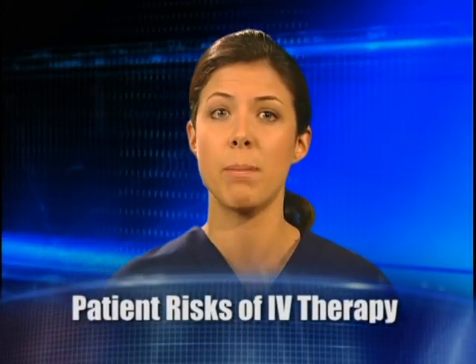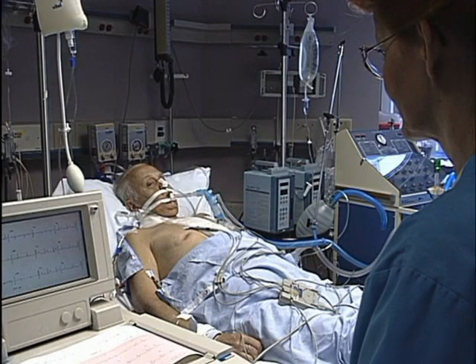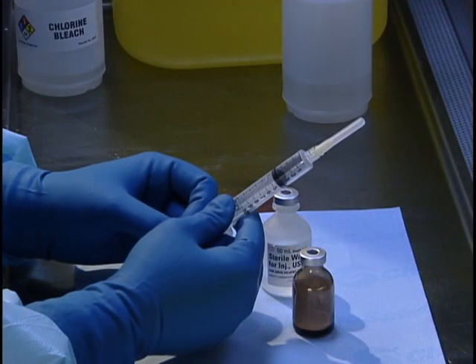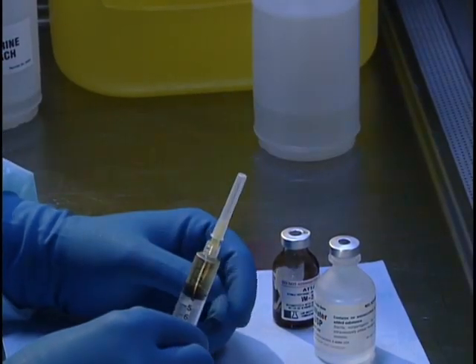While IV therapy offers a rapid, direct means of administering many life-saving drugs and fluids, and a high percentage of IV therapy is administered without any problems, there are some risks. Many of the issues addressed in this training program are aimed at teaching proper technique and therefore minimizing the potential for these risks. The following are some reported complications of IV therapy that can increase the risk to patients.